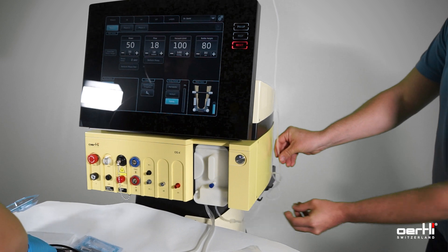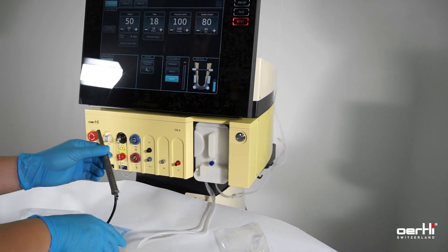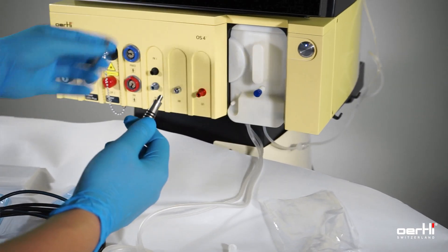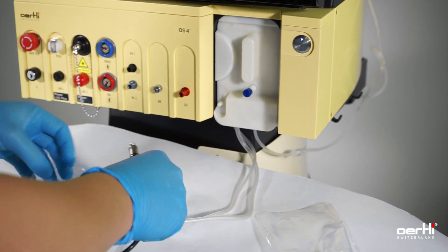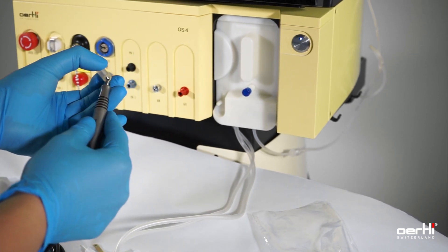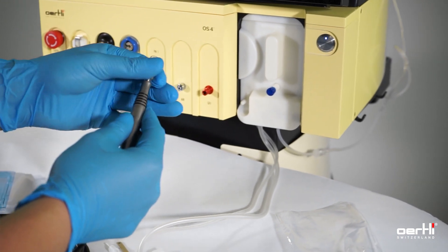Next step: prepare the FACO handpiece. Remove the cover — lefty-loosy, righty-tighty. Grab the FACO tip, righty-tighty.